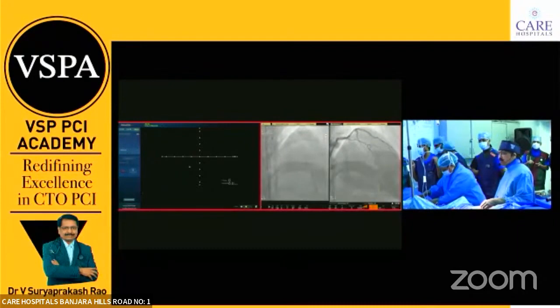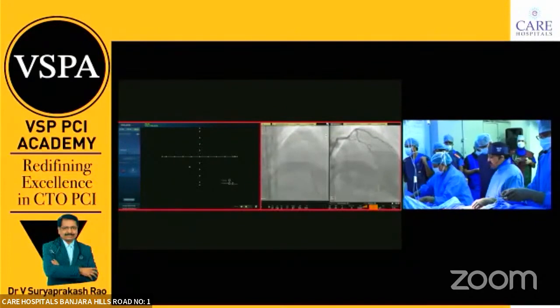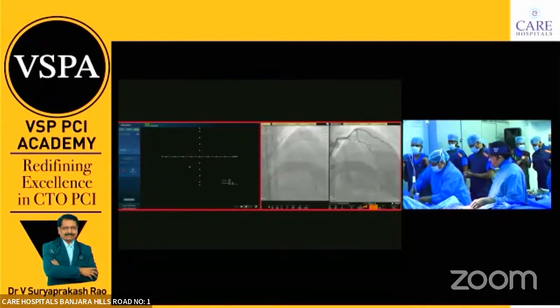You can see just like OCT, all the three layers, and you can see intima, subintima, wire positions, everything can be seen. That's why we prefer this IVUS.